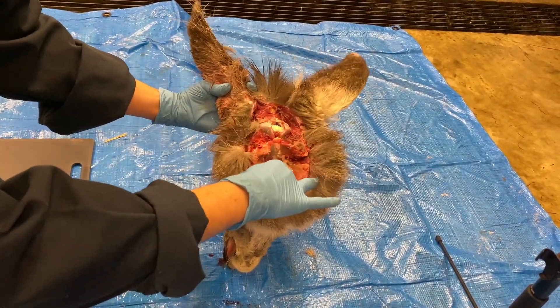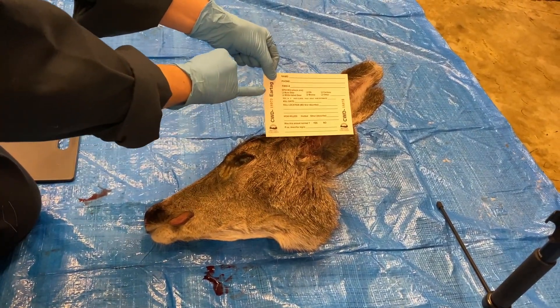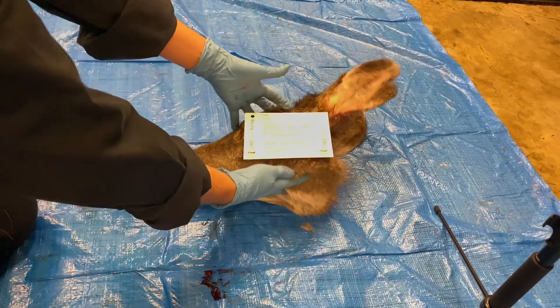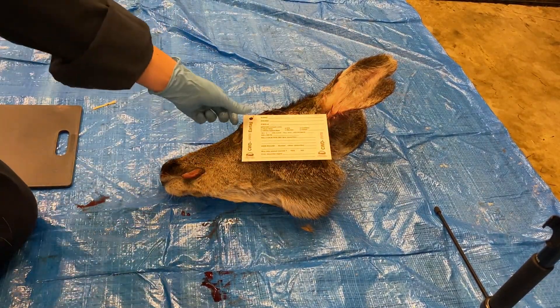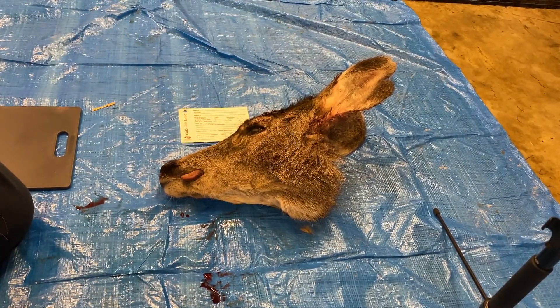At this point you can submit the whole head for testing. Simply fill out an ear card with your information. Make sure you record the number on the side as it is how you look up your results. Poke a hole in the ear, attach the card using a zip tie, place the head in a garbage bag, and drop it off at one of the CWD freezer locations.